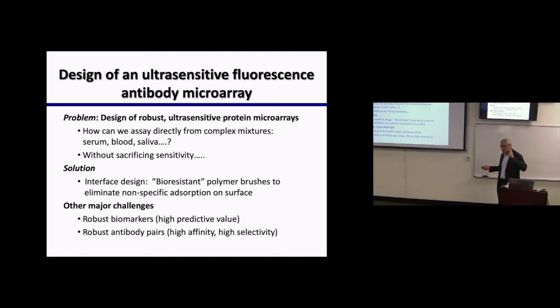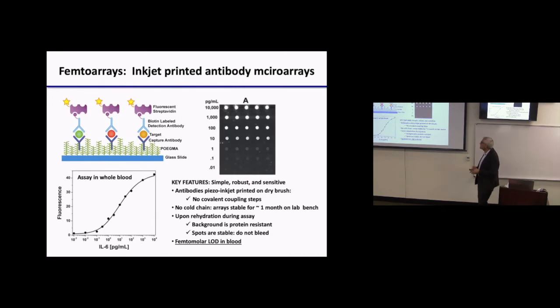There's a whole world of biomarker generation, people who just find biomarkers doing proteomics, genomics, and so on, and the people who design antibodies, and we're going to rely upon that. So the first thing I said was, let's use this to make a sandwich immunoassay. I had a student who developed this technology, and if you ever go to his PhD, his last chapter is actually, he tried to use it for a microarray.